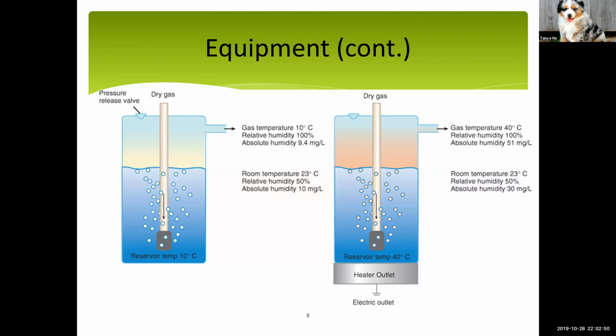In this picture here, it's demonstrating that adding heat increases the output. If you look here, this is like a bubble type of humidifier. So the gas is coming down through here. It goes through this little filter, and then it breaks up the gas stream into little bubbles. And so the bubbles form and they flow out and they flow up, of course, because air goes up. And then it floats up through the water and then out. Okay, so that's basically how a bubble humidifier works, okay?